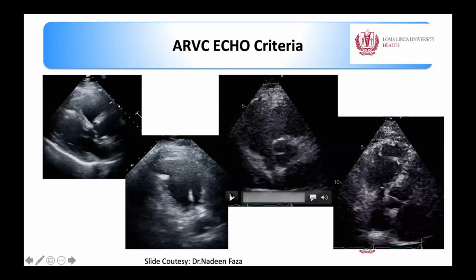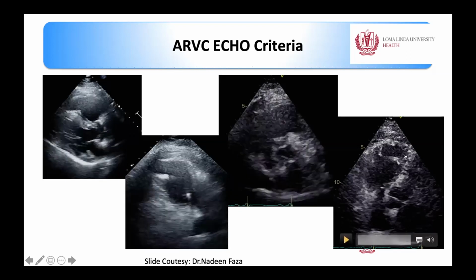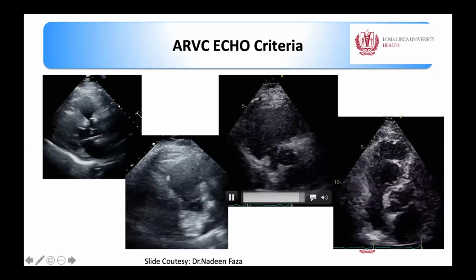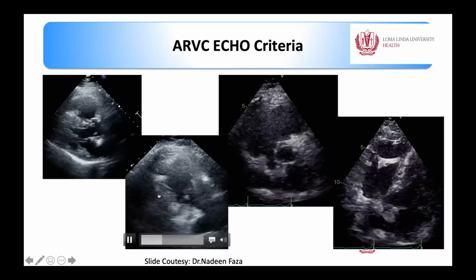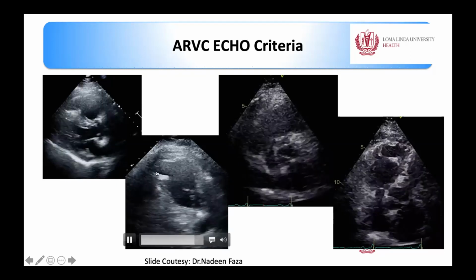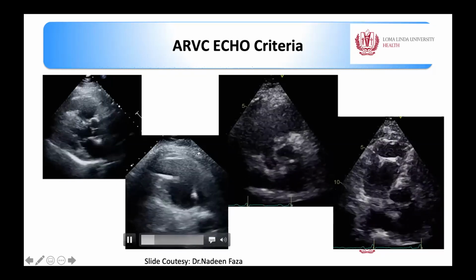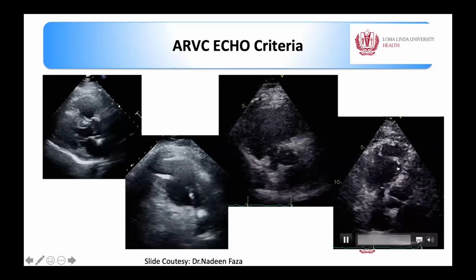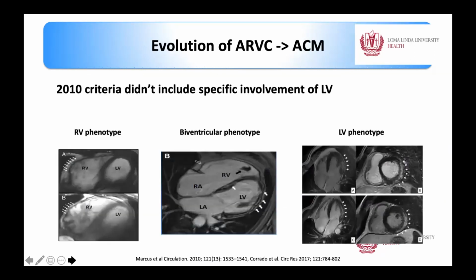So this is an example of one of these patients, and you can see that the RV is quite dilated. There is some involvement, and again, these are tough patients to diagnose on echocardiography, depending on the acoustic windows. But right here, you can see that there is not much movement in this area. And you can appreciate it again in the short axis view. So just real quick, it can have an RV phenotype, a biventricular phenotype, and a predominant LV phenotype. I just wanted to show you all.